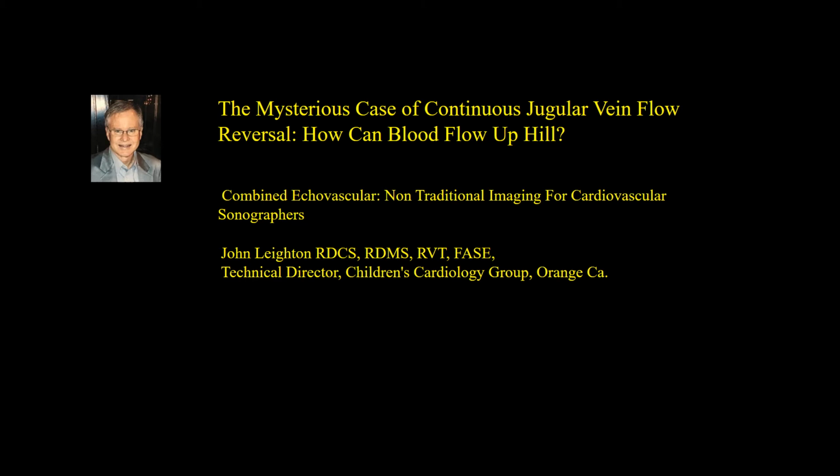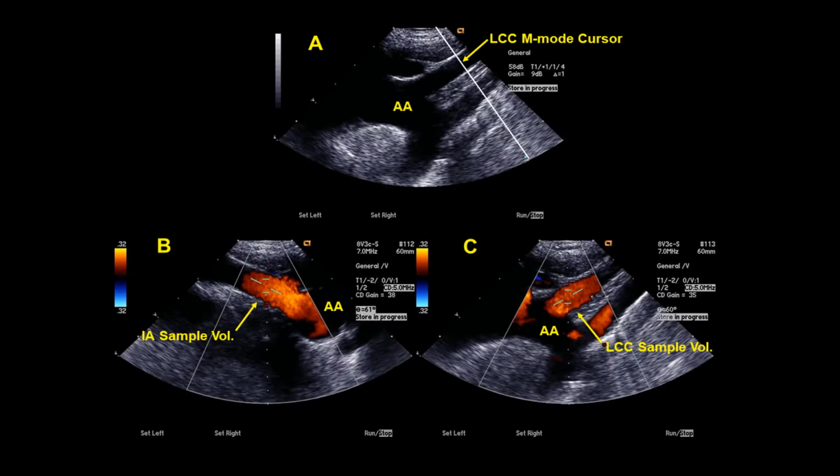We've got an amazing case for you today. We're going to see how blood can flow uphill. And we're going to stress using non-traditional imaging to do a vascular ultrasound assessment. So this is how we do the vascular ultrasound assessment.